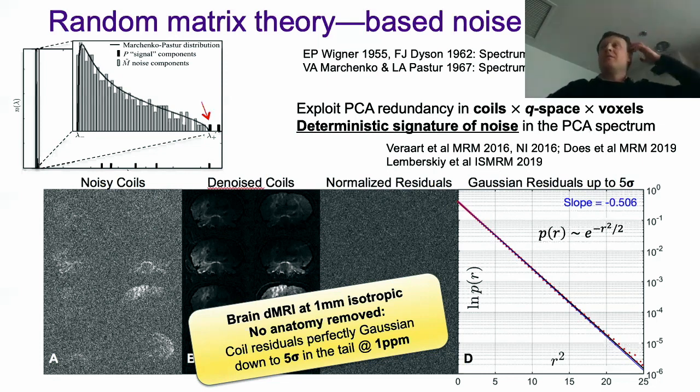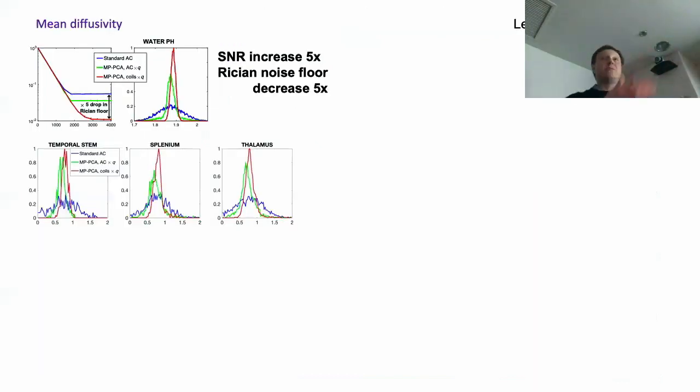So are you applying this to complex data? Yes, of course, at each coil complexly. I have one question on the comparison. The denoised coils all use all the diffusion data, right? Yes. Wouldn't it be a fairer comparison to other noisy coils that you average n times as many directions? Because the diffusion analysis kind of averages over multiple images. Yes, I understand, but the whole point is to use the whole stack to increase the redundancy. And that's why the results are much better, and not to reconstruct it for visual comparison.